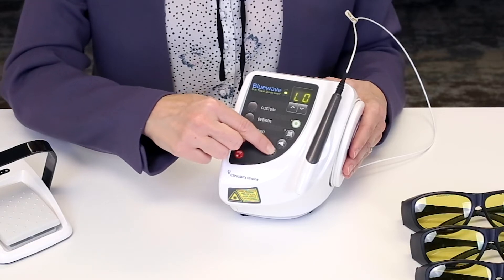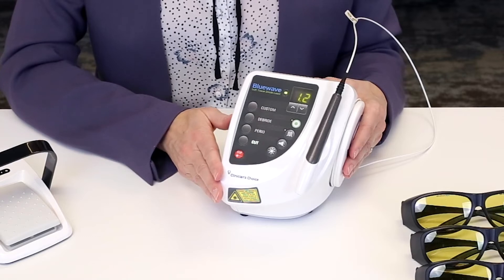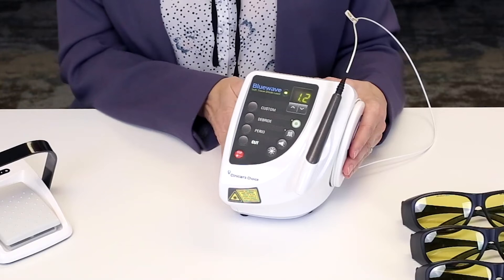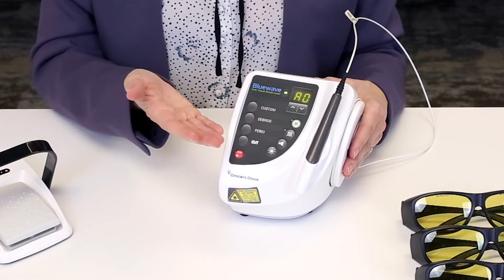There is a brightness button for both the display and for the aiming beam. You can adjust your brightness here. If you find that the beeps can be a little bit annoying in your office, you can turn them off or on by pressing this button.